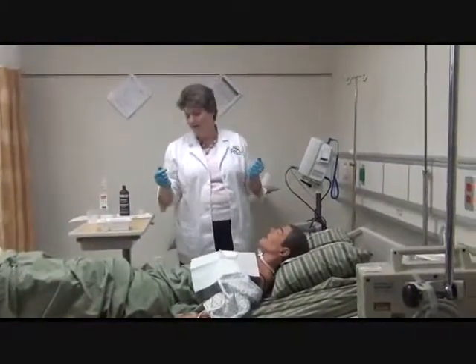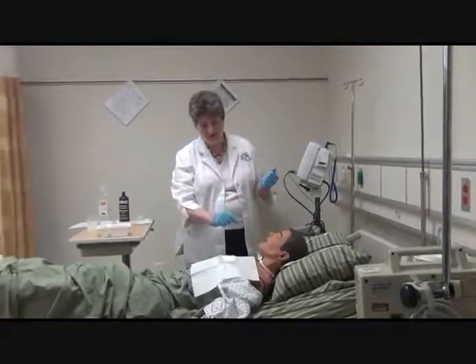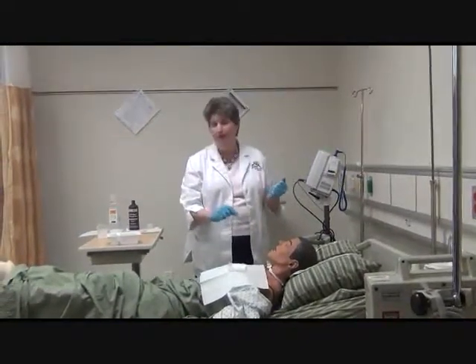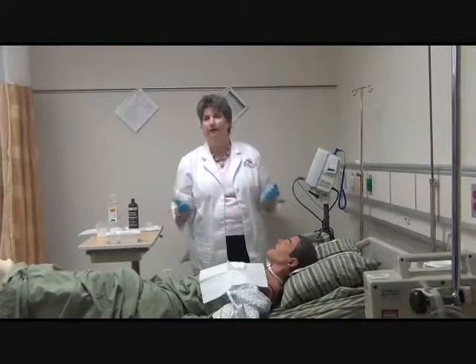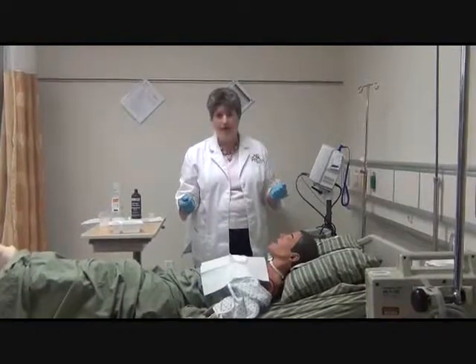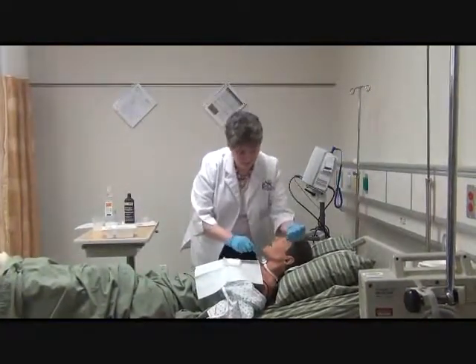So again, a couple different ways to do this. If you have a lot of secretions on that cannula that are hard, I will put this in and let it soak longer. If the patient has thin secretions, it's going to be easier to clean up. Then you'll clean it up and put it in right away.